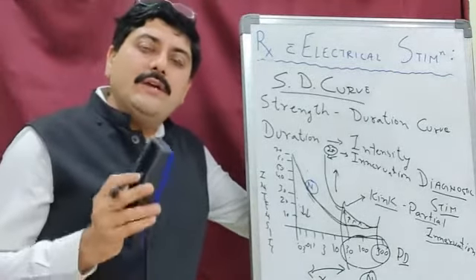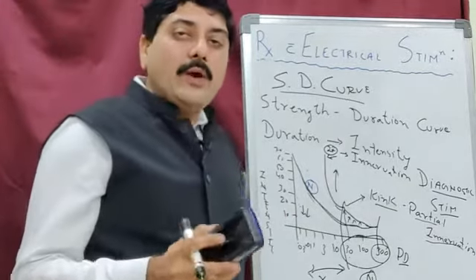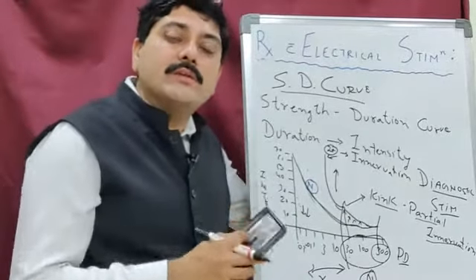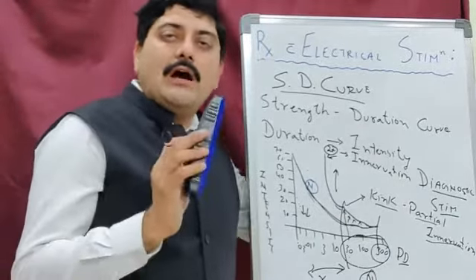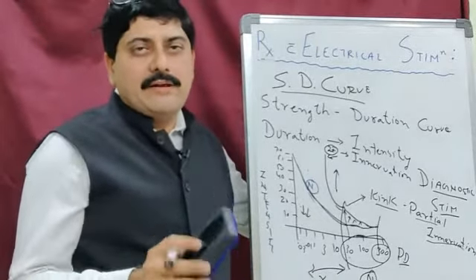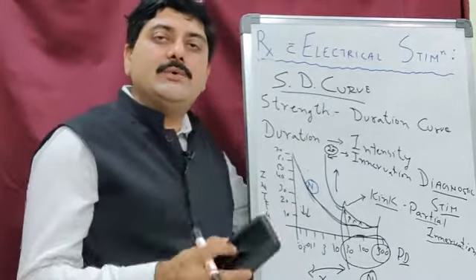Okay, this particular curve that I have shown here is known as the strength duration curve. The strength of contraction based on the intensity required for stimulation on broader durations and moving towards the shorter durations. So after receiving the patient, we have done the Faradic galvanic test, and after the Faradic galvanic test, we have gone for taking the strength duration curve.